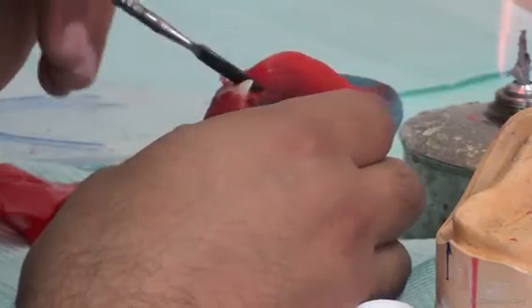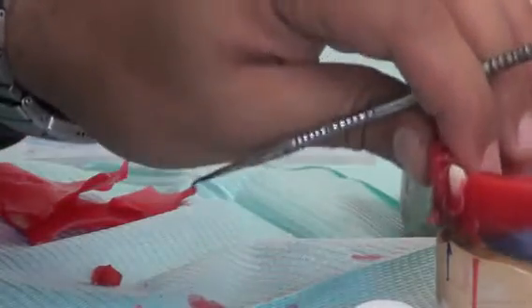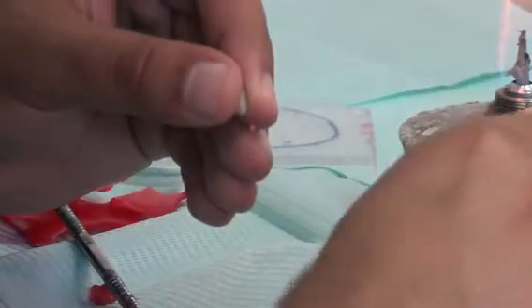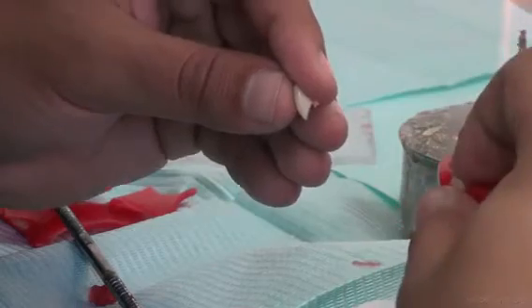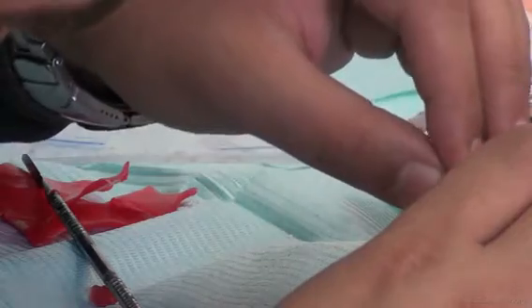Fixing the tooth in place by melting the wax around it. When the wax is molten around the tooth, it will become soft and more adherent, so it fixes the tooth into place. Now we're taking the other central incisor because we want to observe and preserve the midline.